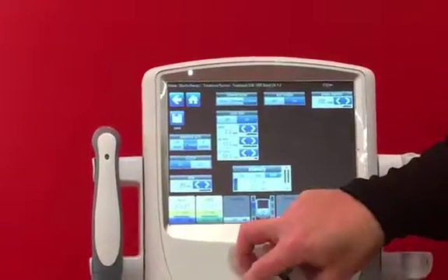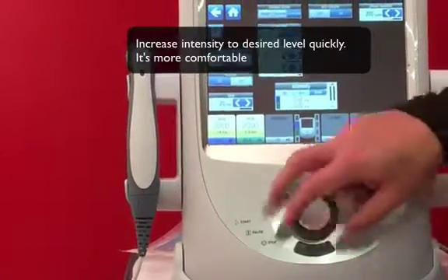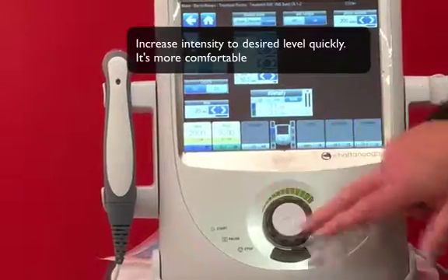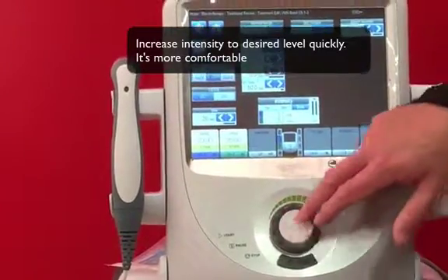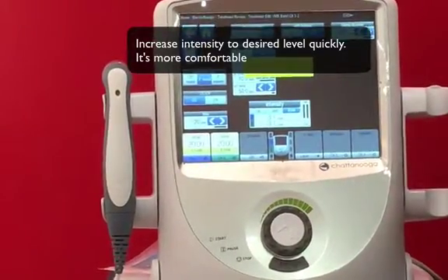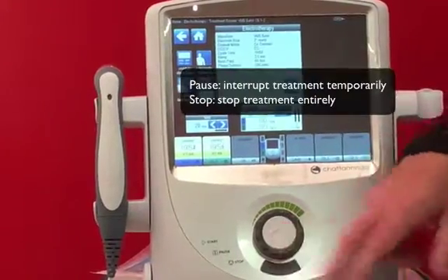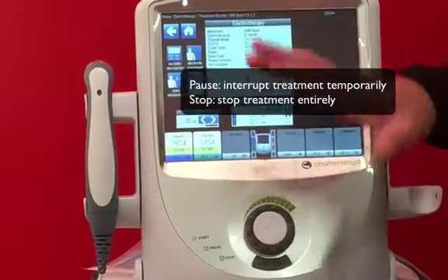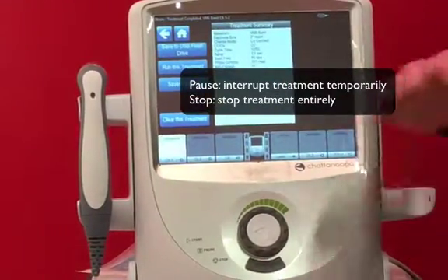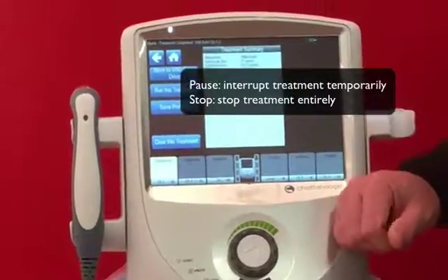Amplitude is set with the dial. As you increase the dial, the amplitude increases — remember to get to the target level as quickly as possible, because the longer it takes, current density is being introduced into the patient without a full cycle running. A cycle won't initiate until you actually hit the start button. Pause is interesting because it allows you to cease treatment without resetting it, whereas hitting stop ends treatment and requires you to reset the entire set of parameters to reinitiate.